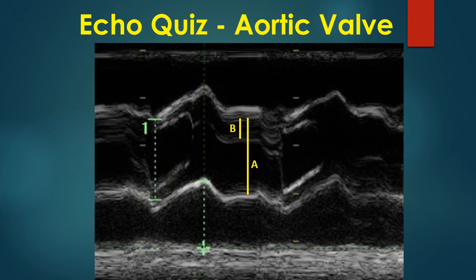the diastolic diameter of the aorta is represented by A. Half of it is taken for calculation of the eccentricity index. B represents the minimum distance of the diastolic coaptation line from the nearest aortic margin.